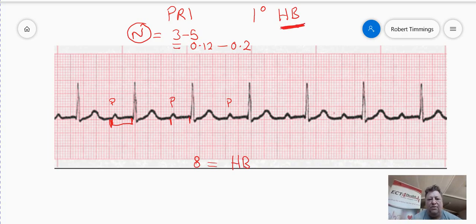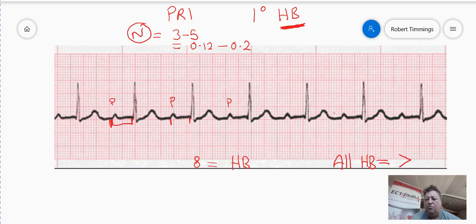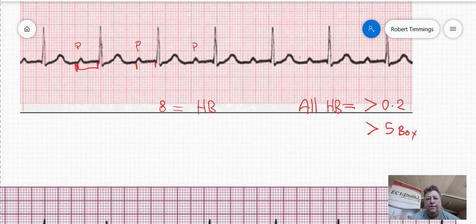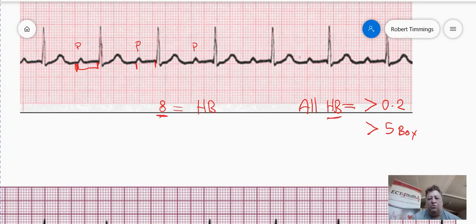All heart blocks share one thing in common. All heart blocks — whether they're first degree, second degree, or third degree — have a delayed PR interval of greater than 0.2 seconds, or greater than 5 little boxes. So the question is: if it's a heart block because there are 8 little boxes, greater than 5, what makes it a first degree heart block as opposed to any other degree?